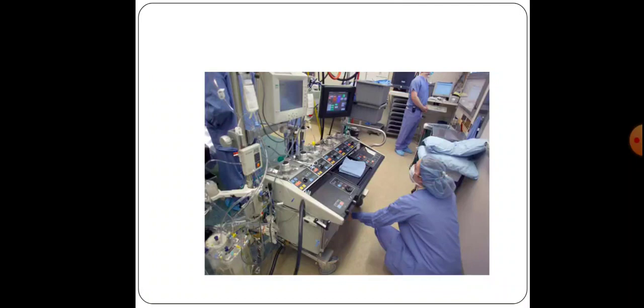So this is the picture of the heart lung machine, which is used in the operation theatre mainly to bypass the function of the heart and lung. So here there will be a heart lung machine. A doctor is using the heart lung machine to provide the amount of oxygen to the patient, and also he will control the amount of blood flow to the patient. So let's see what are the components involved in heart lung machine and where it is used and when it is used. Like that we will see in the upcoming slides.